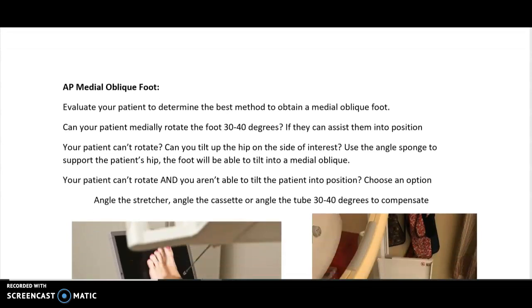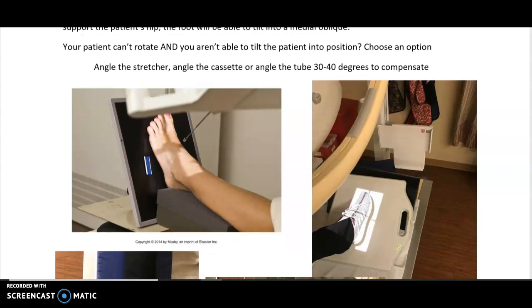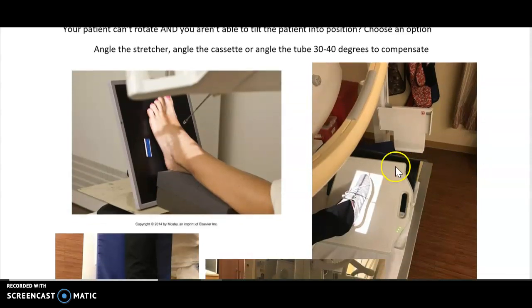For the oblique foot, evaluate your patient. Can they drop their knee directly into an oblique position? If they can oblique for you, go ahead and do it as normal. If they can't rotate, consider tilting up their hip on the side of interest using an angle sponge — sometimes tilting the hip up will cause the foot to automatically drop into an oblique position. If they can't rotate and can't be tilted, you have several options: you can angle the stretcher, angle the cassette, or angle the tube 30 to 40 degrees to compensate.